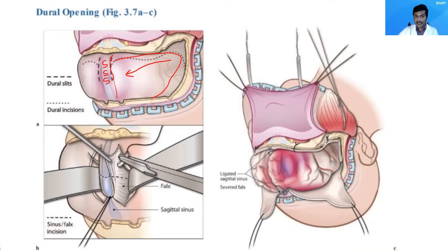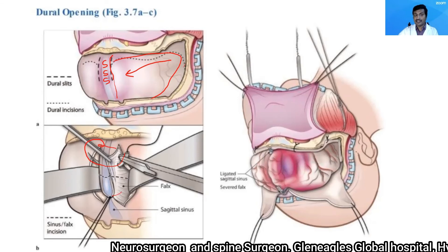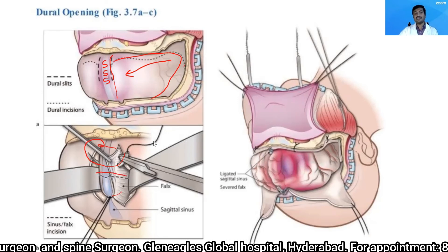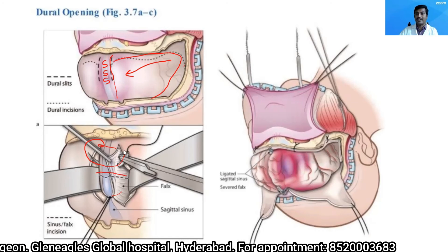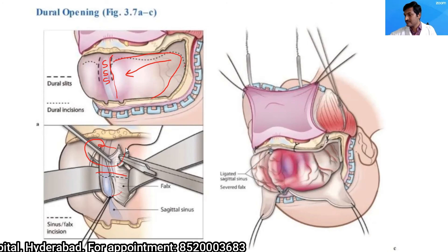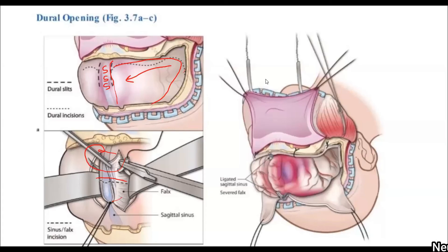For superior sagittal sinus ligation: pass a needle through the falx cerebri, take it across, and ligate the sinus thoroughly. Take a second ligature, then cut the superior sagittal sinus between the two ligatures. The ligatures must not slip; a double ligature can be taken if required. This completes reflection of the dura mater.